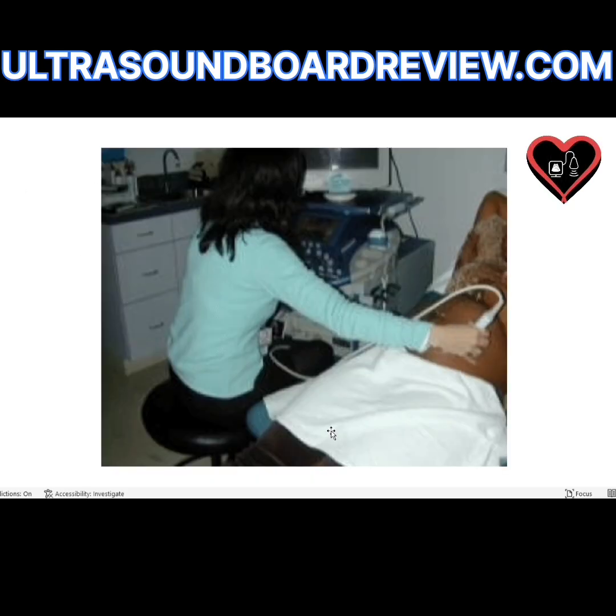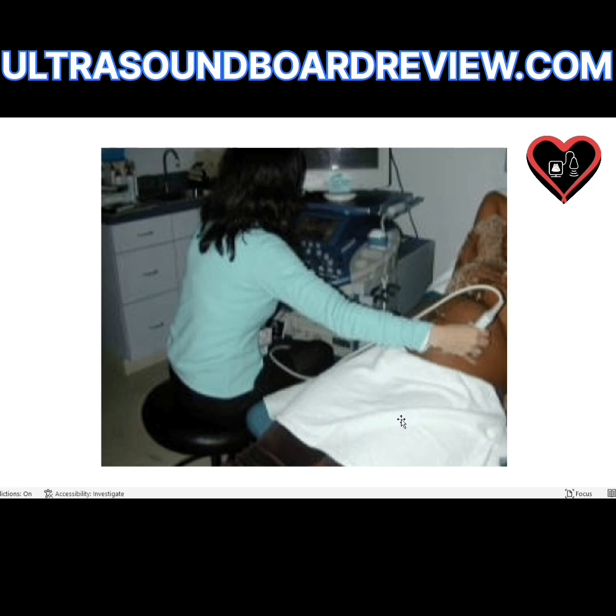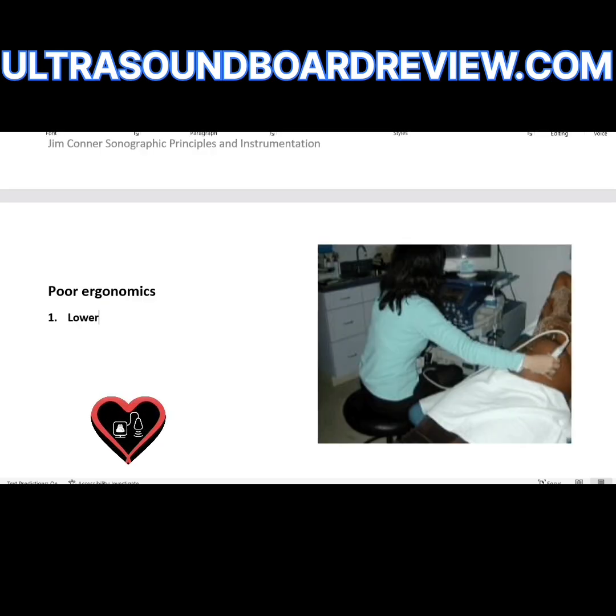How do you fix this image? For starters, it looks like the bed might be a little too high, and she's also kind of leaning to the right. If the sonographer would just lower the bed down to the level of the sonographer's hip, this might ease the tension during the ultrasound. The only thing that looks correct here is the way she's scanning — the wrist is not bent, and it looks like the fingers are curled and relaxed. So lower the patient's bed to hip level.